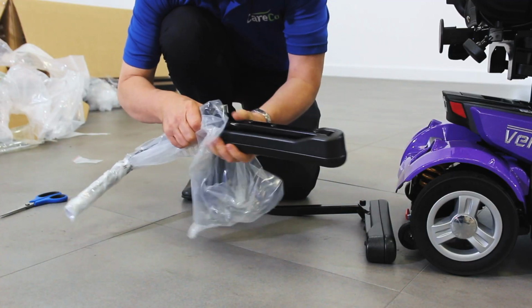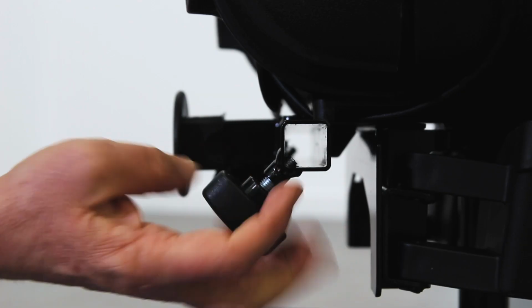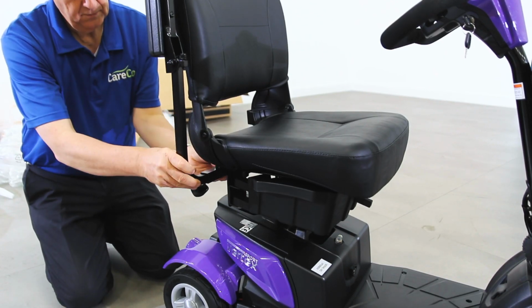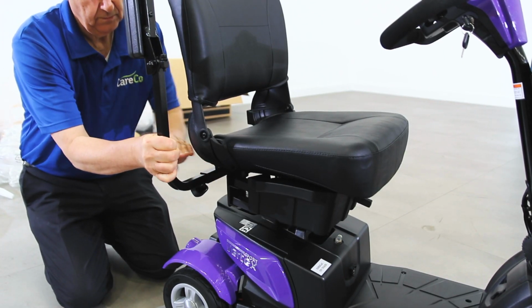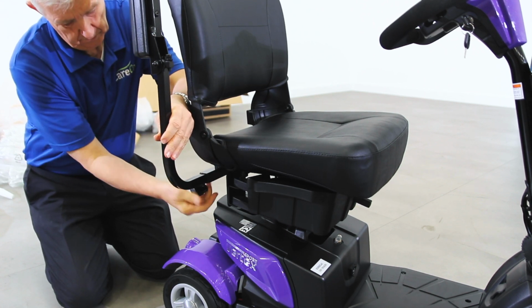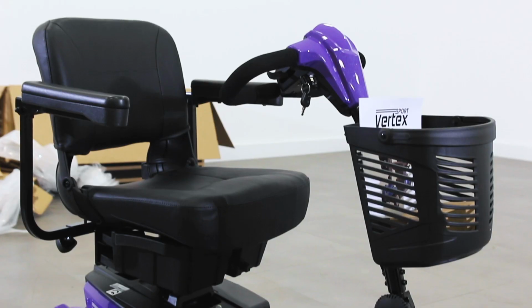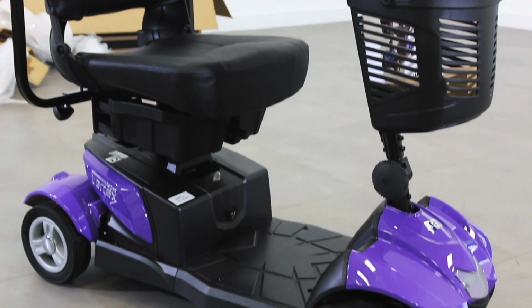Now you can add the armrests. Loosen the knobs at the back of the seat frame. Then slide in the armrest. Once you have found a comfortable width of the armrest, secure it to the seat by tightening the knob underneath. Now repeat this process on the other side. Your I-Go Vertex Sport is now fully assembled.